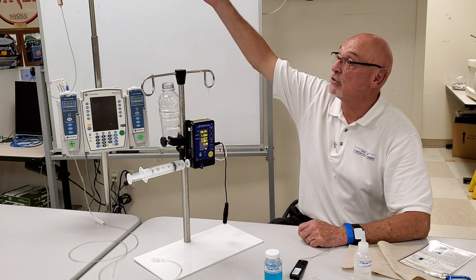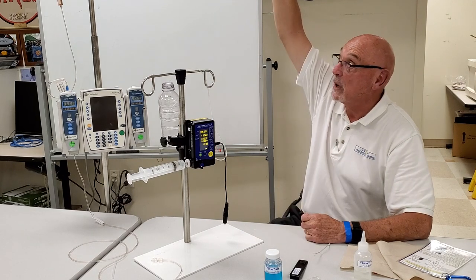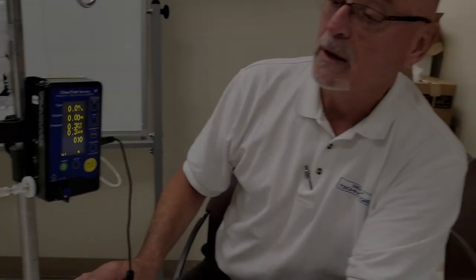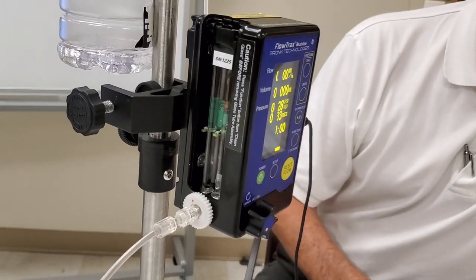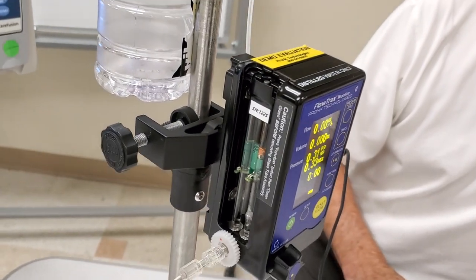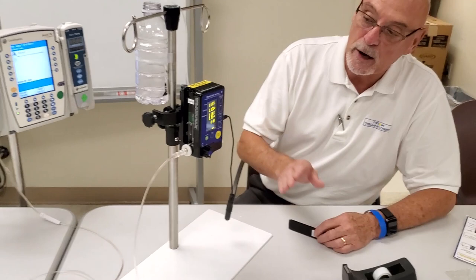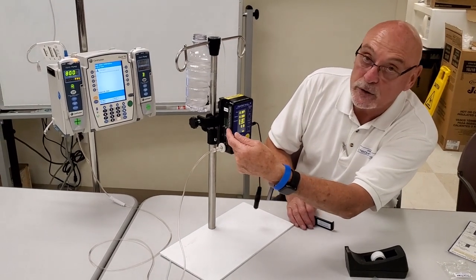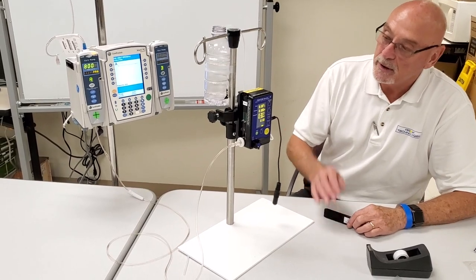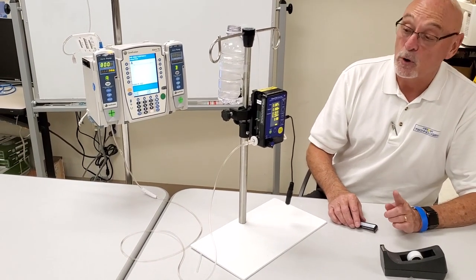You can also prime using gravity flow — just from the IV set down to the Flow Trax, raise the height of the bag to ensure good flow. Now, it's important to put the side cover back on if you're near sunlight. Because they're optical sensors, infrared light from sunlight will interfere with them. For our demonstration purposes we can leave the cover off so you can watch the bubble, but keep that in mind in practice.